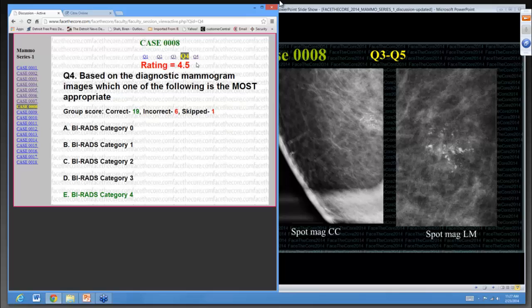Also the breast thickness. The general rule is 2 centimeters in breast thickness. If it's less than 2 centimeters, it can be a difficult biopsy to do. The patient may not be amenable for a stereotactic biopsy. In that case, the patient needs a wire localization procedure.